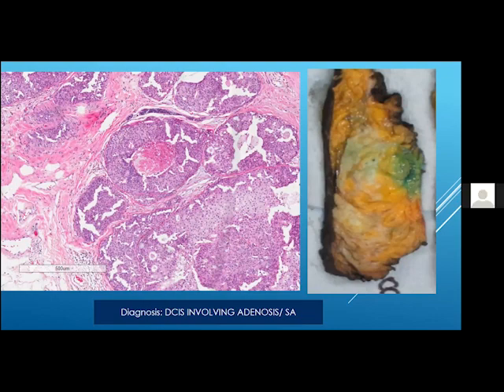Well, we usually use more than one myoepithelial marker, as you mentioned. And especially for this one, it's not convincing like invasive carcinoma.